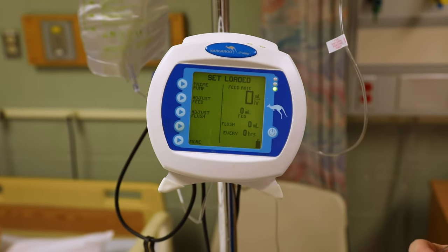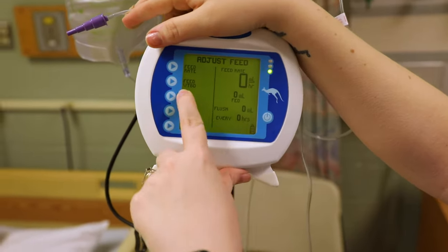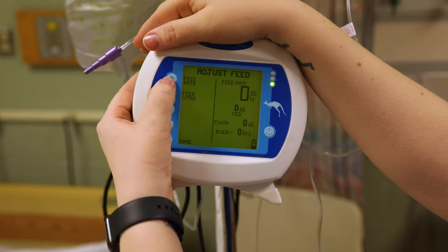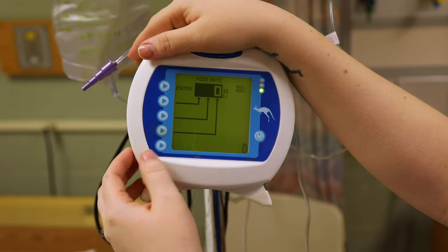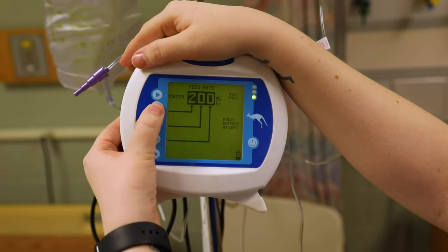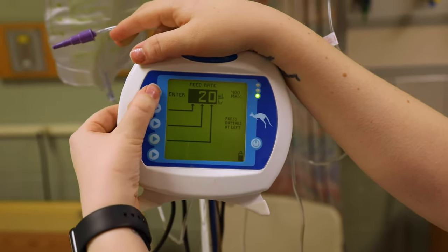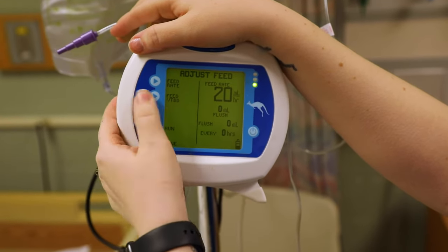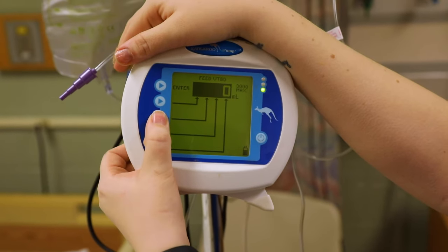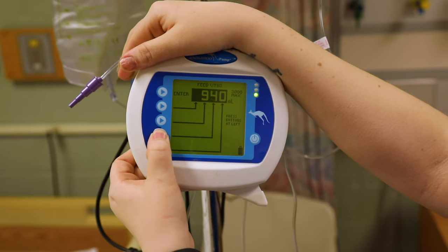Now check your orders and go to 'Adjust Feed.' Enter your feed rate — VTBD, which stands for volume to be infused or volume to be administered. We're going to say the doctor ordered 20 ml's an hour. Be careful with these arrow buttons — if you accidentally push it too much, just keep pushing and it'll go back down to zero. Enter 20 ml's an hour for the feed rate. For volume to be infused, this formula has 1000 ml in it, but I tend to go a little lower — like 950 — so it alerts me before it's completely empty, giving me roughly two to three hours' warning to order another bag.